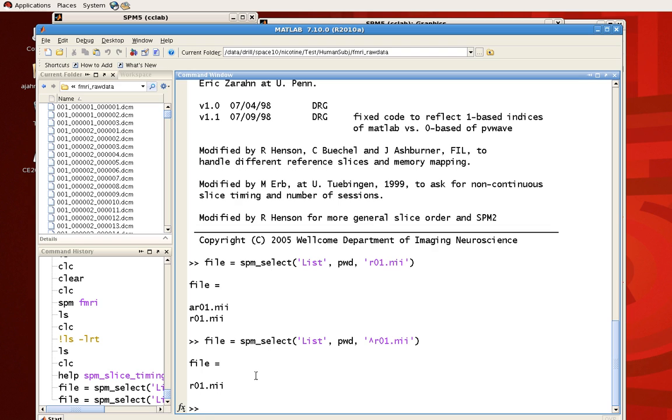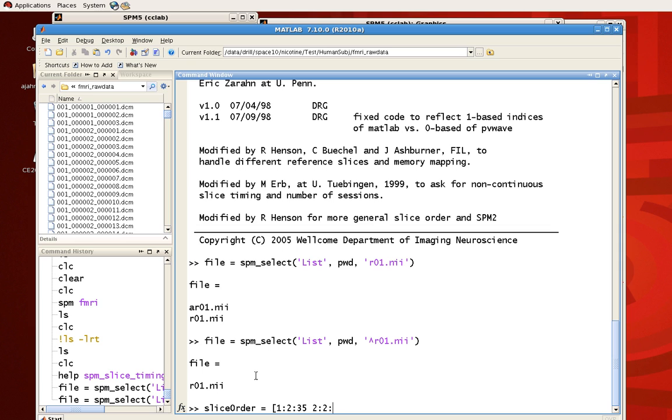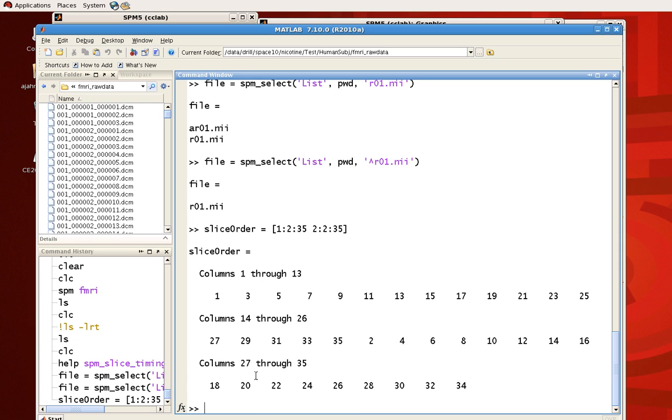The second thing it needs is a slice order. In this case, we acquired slices in an interleaved fashion. So slice 1, 3, 5, etc., until slice 35, and then go back and acquire slices 2, 4, 6, 8, and so on until the very end. So let's call this variable slice order. We're going to use the MATLAB function of concatenating steps of numbers. So 1 to 35, stepping by 2, and then concatenate that with 2 to 35, also stepping by 2.